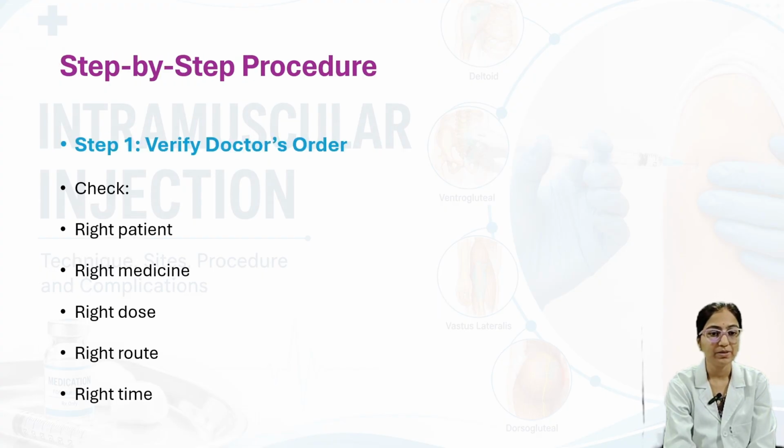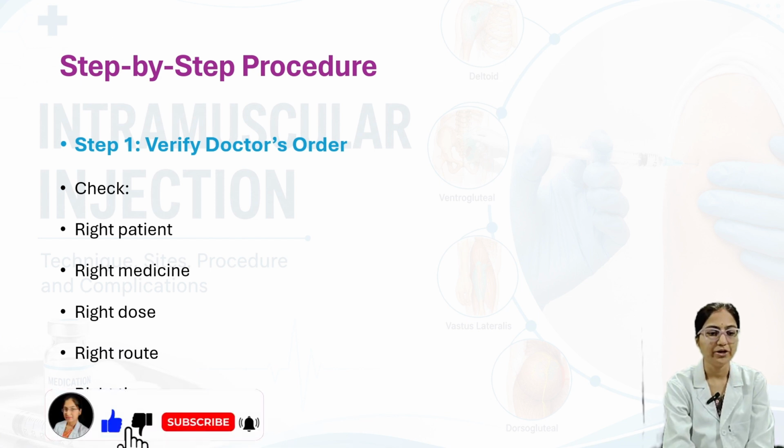Next we'll see the step-by-step procedure here. It's very important. Step 1, verify doctor's order. We need to check right patient, right medicine, right dose, right route, and then right time. This is the first step.